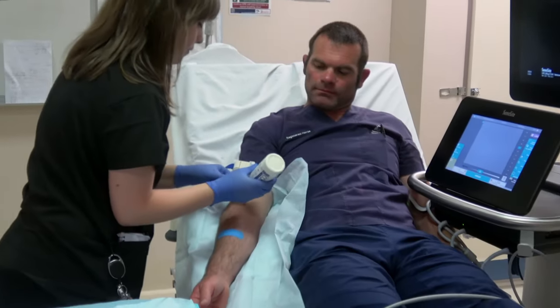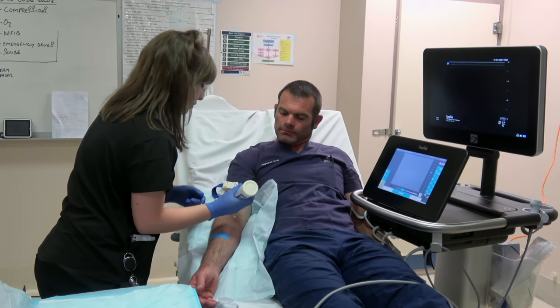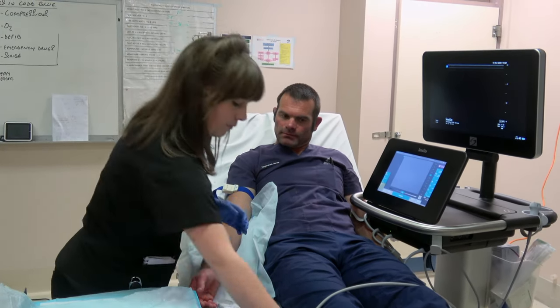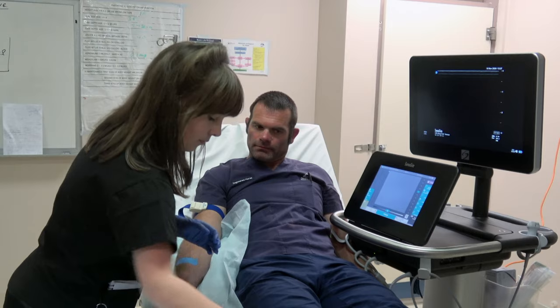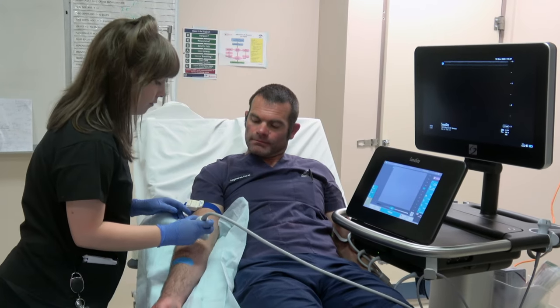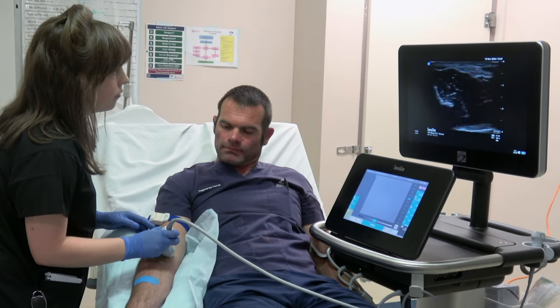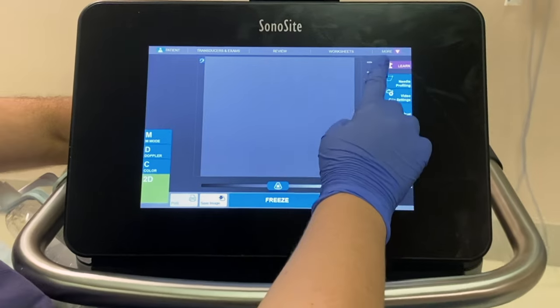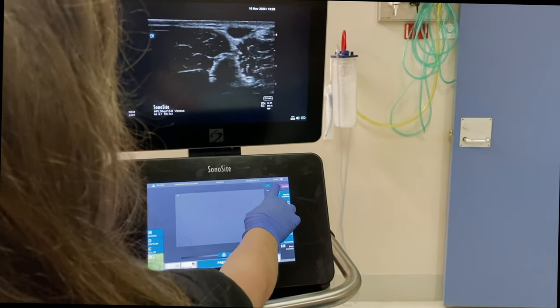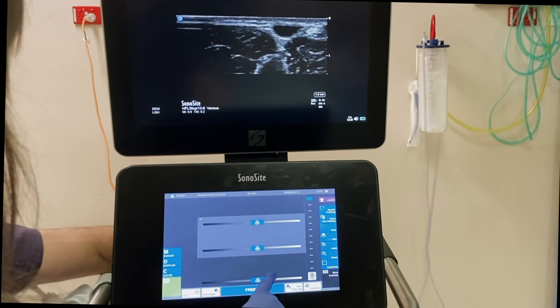Apply a tourniquet as high up on the arm as possible to maximise your selection of veins. It's highly important to perform a scout scan. This can be done with standard conduction gel. Please take note of the blue probe marker and the depth — in this case 3.5cm. The probe should be correctly orientated, with the marker to the left in the transverse approach and upwards when longitudinal. Optimise the depth to focus on the vein and important surrounding structures. Now optimise the gain as needed.